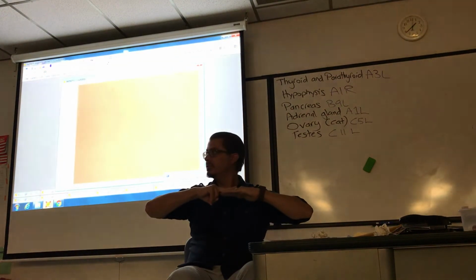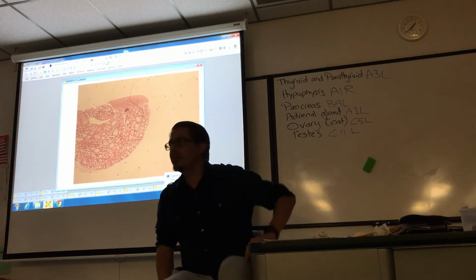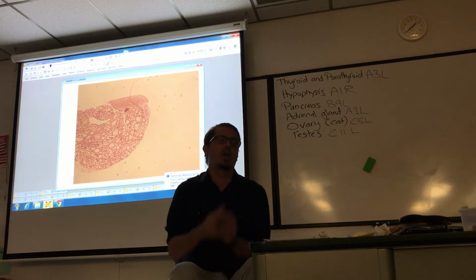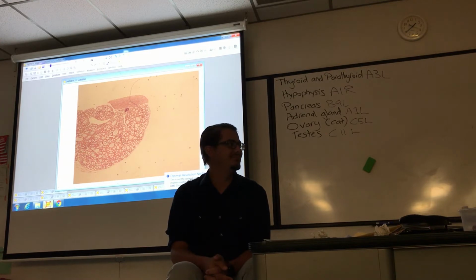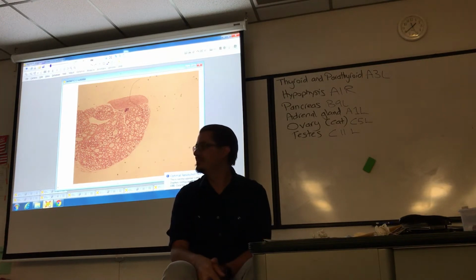I want to get a chair so I can sit. Let's see here. Is there a chair available? I'll just use my black one. It's okay. So this is a low magnification.